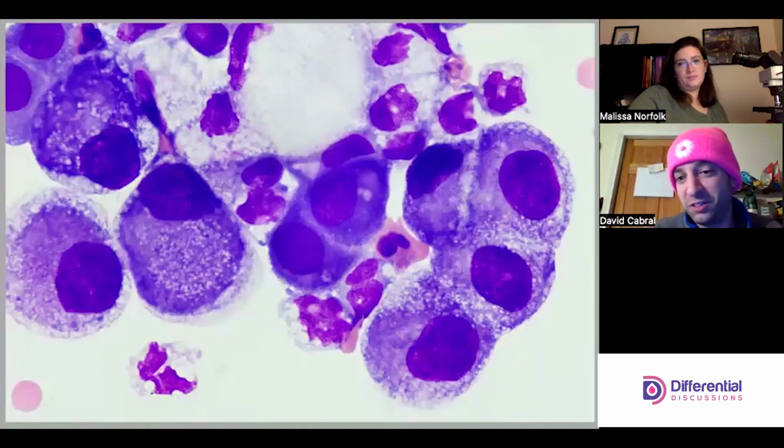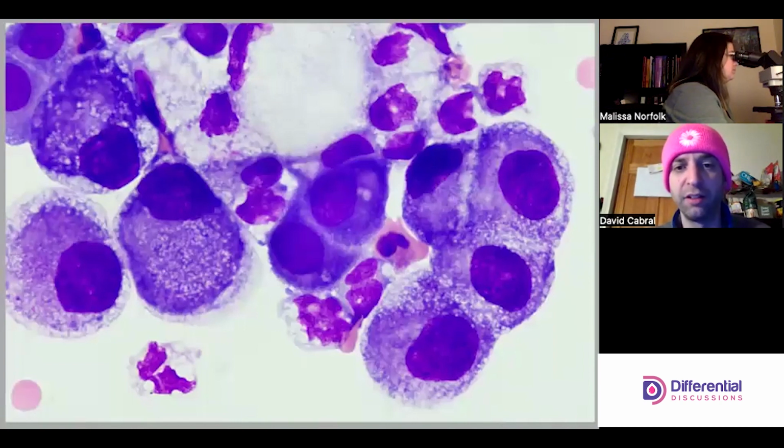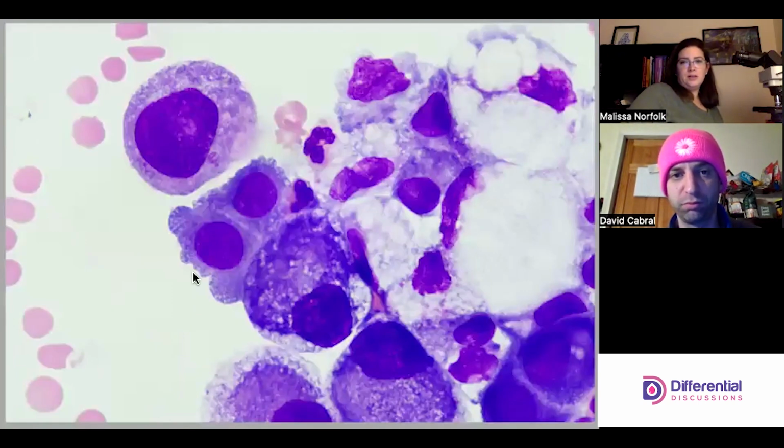It's possible. Could be. But yeah, I think on this slide I'd be quite heavy-handed, and if the pathologist wants to adjust a count, they can. Over here, these look a little more meso, these two. Absolutely, yep, let's agree with you.